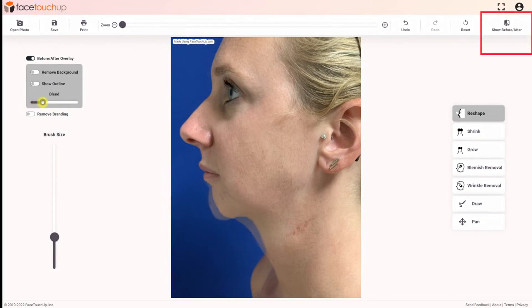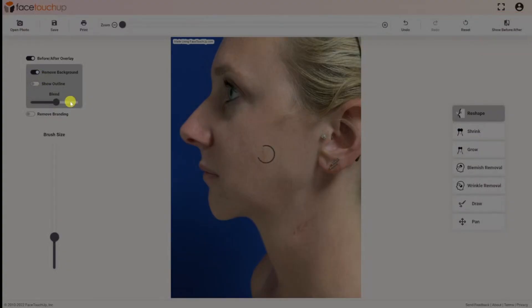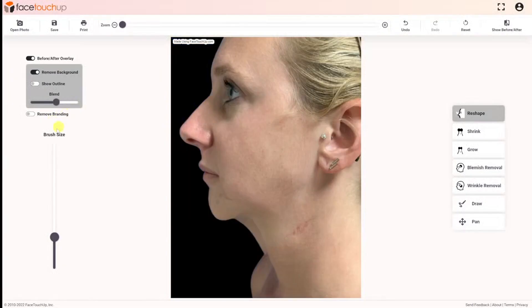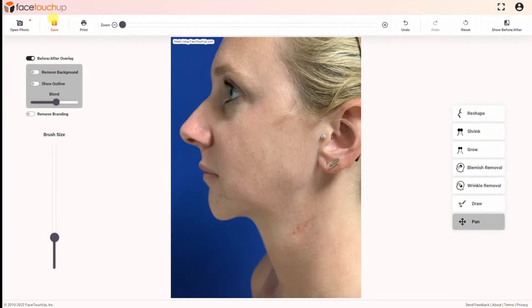Click the show before or after menu item to see the result in an animation. The animation gives a clear representation of the changes a patient can expect.